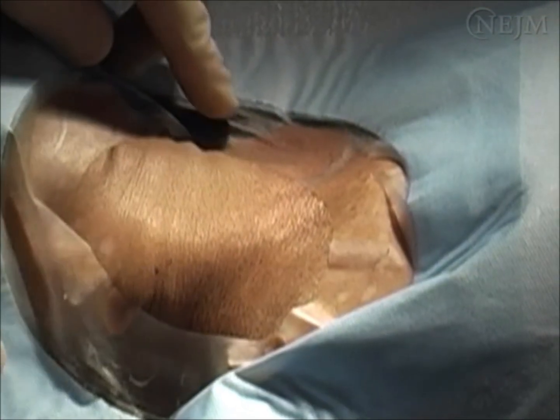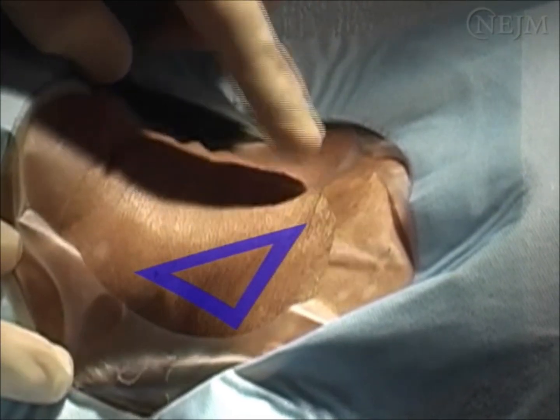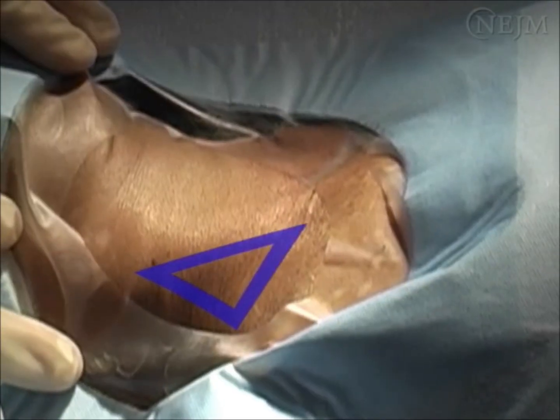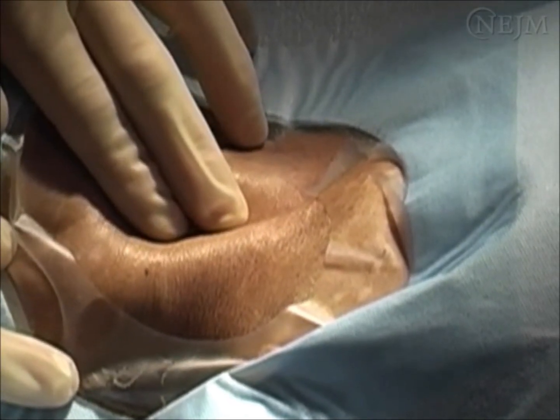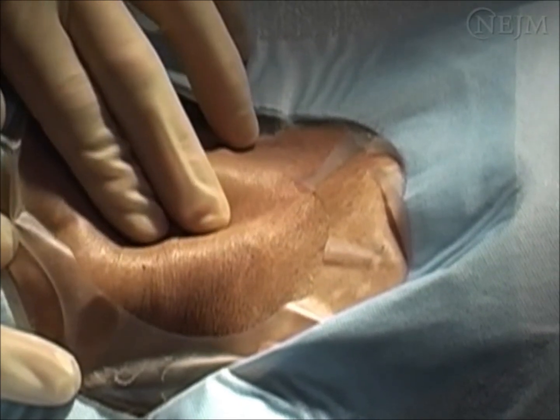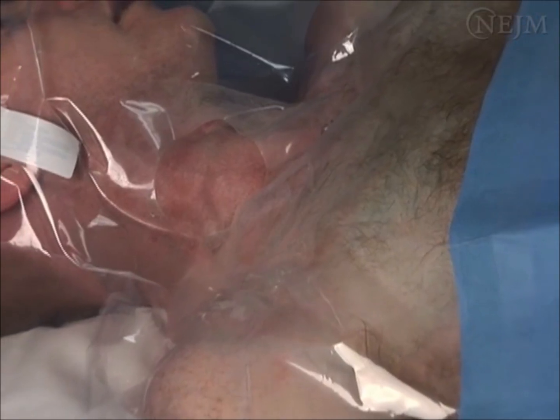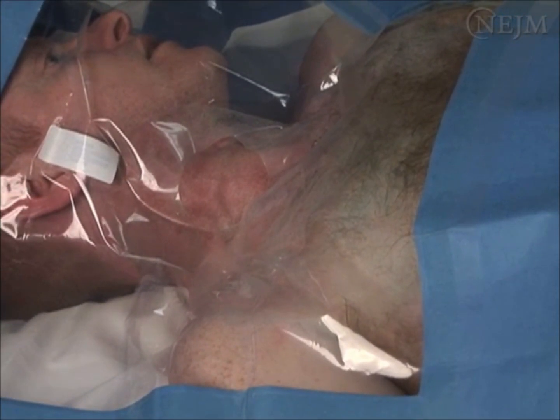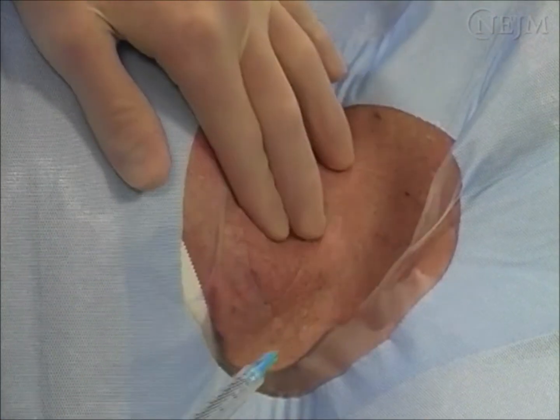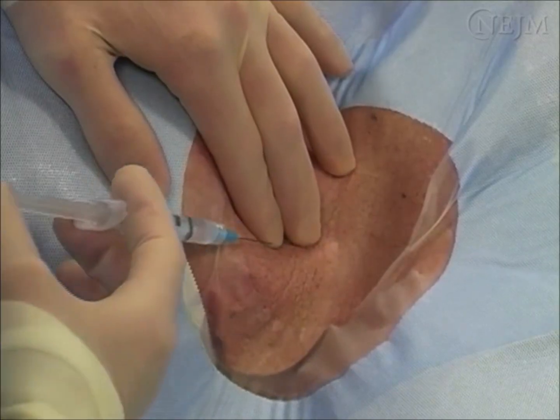Confirm the needle insertion site again. Generally, it is at the apex of the triangle, just lateral to the carotid pulse. During needle puncture, palpation of the carotid artery can be maintained with the non-dominant hand. In a patient who is awake or minimally sedated, the skin should be infiltrated with a local anesthetic, such as 1% lidocaine, with a 25-gauge needle to help minimize pain on insertion of the catheter.